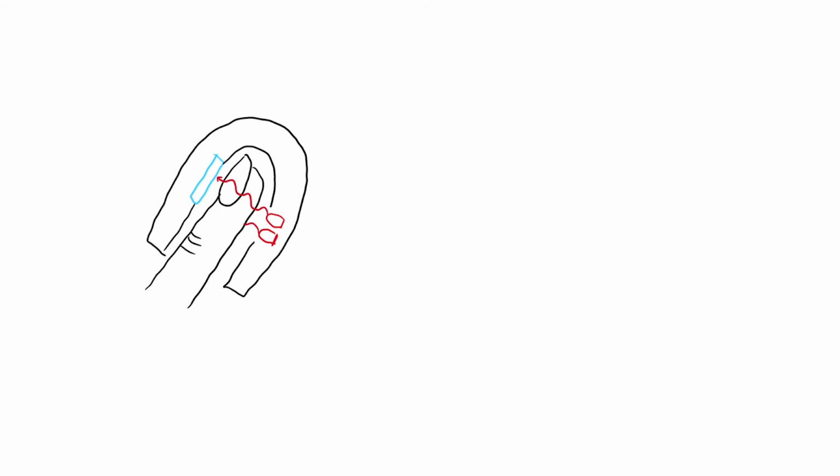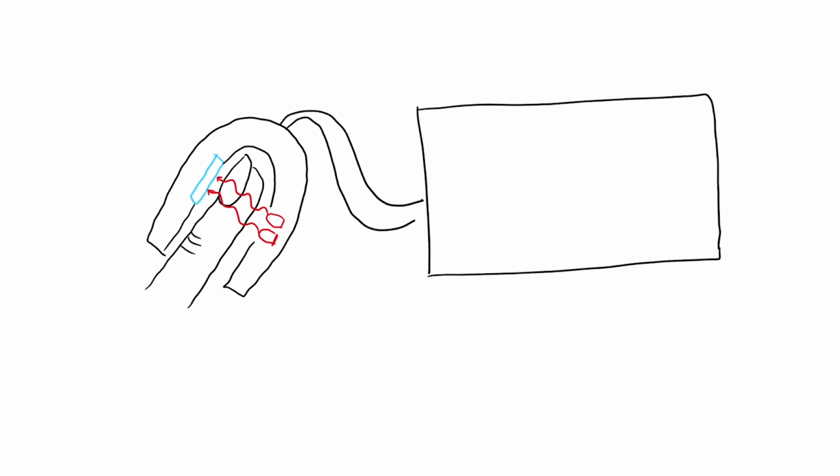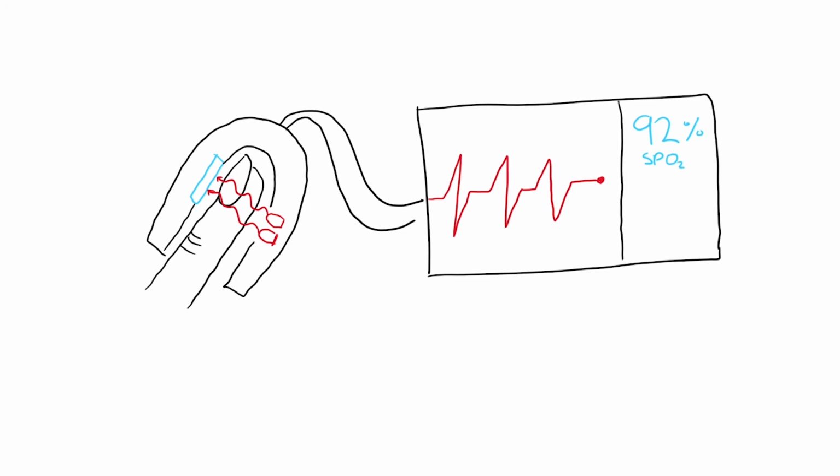Pulse oximetry is a common practice where IR is used in a hospital setting. Pulse oximetry is the equipment that measures the heart rate and blood oxygen saturation of the patient. Commonly, this is a finger probe, which shines 2 wavelengths of 660 nanometers, red light, and 940 nanometers, infrared light. The oxygenated hemoglobin in the blood will absorb more infrared light and transmit more red light. The ratio of red light to infrared light is then converted to blood oxygen saturation using a lookup table based on the Beer-Lambert law. As only 2 wavelengths are absorbed, a Fourier transformation is not required.